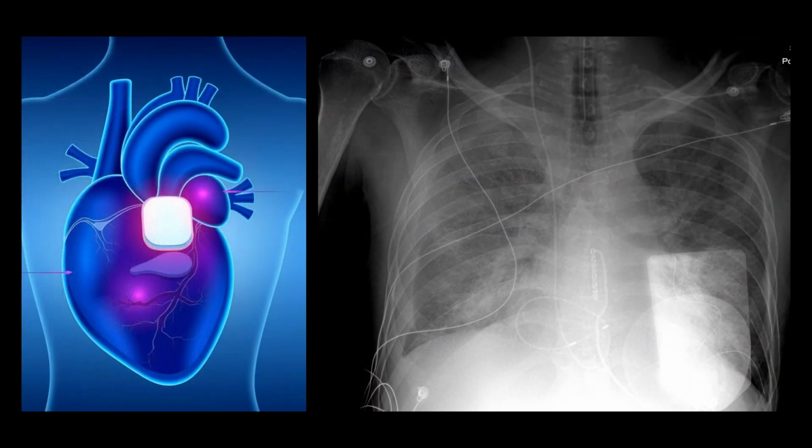This is an X-ray showing how the pacing gel pads appear in the X-ray. One is in the anterior position and the other one is in the back of the patient. So part of the lung will be hidden by the gel pad. If we use one at V1 and the other at V5, there will be hiding of the lung behind the gel pad, and part of the lung from the other side will be hidden, and the pathology will be hidden by the pads.